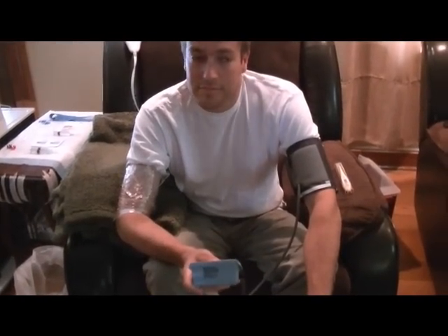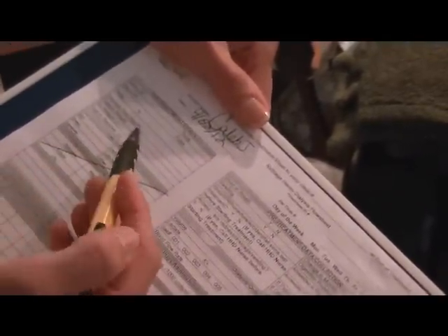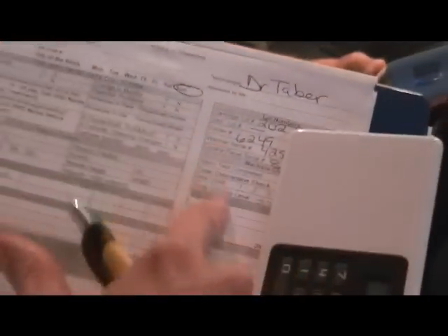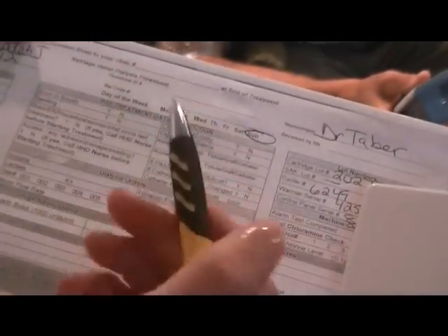Before we start the dialysis, he has to do a sitting blood pressure and a standing blood pressure, his temperature, and his weight. We record everything on here — the sitting, standing, and his post weight. How you know how much fluid you're actually going to take off is we have a dry weight, which his is 80.5 kilograms. He weighs himself, we write it down, subtract the dry weight, and that's how much fluid we set the machine to take off. It also asks questions like are you short of breath, swelling, have you been to the ER. We record what solution we're using and confirm his fistula — that you can hear and feel the thrill and the bruit.